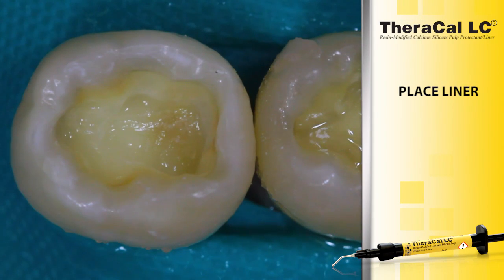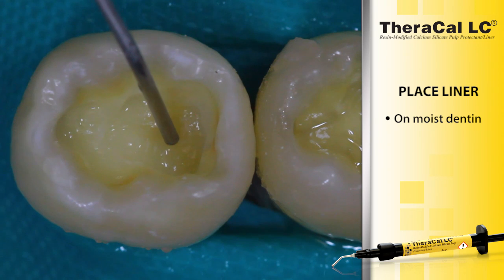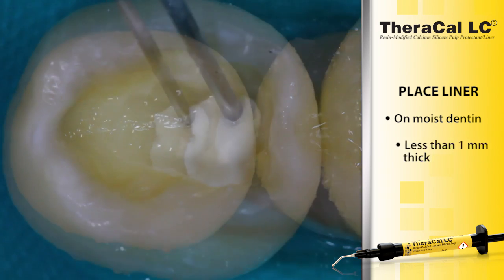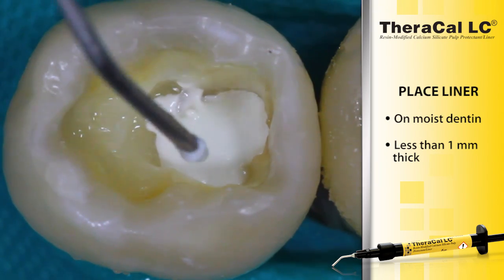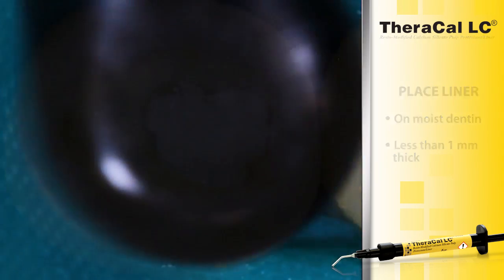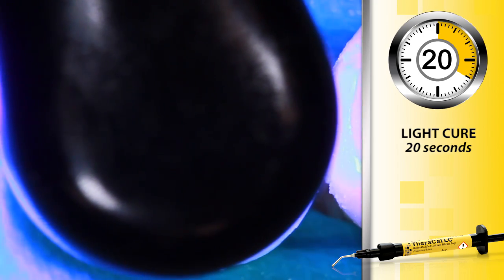Theracal LC is placed on visibly moist dentin in order to achieve a proper bond. It is placed in layers less than 1 mm in thickness to allow for proper polymerization. Light cure each increment of Theracal LC for 20 seconds.